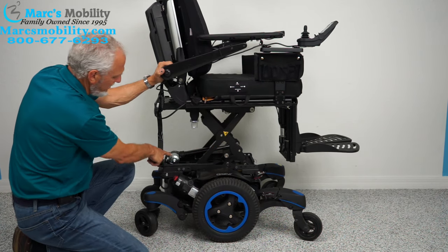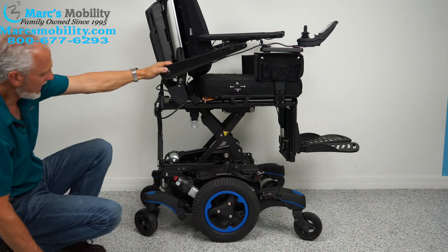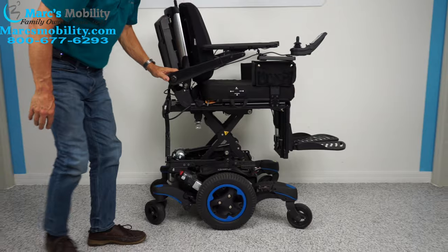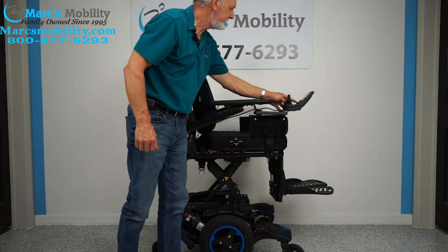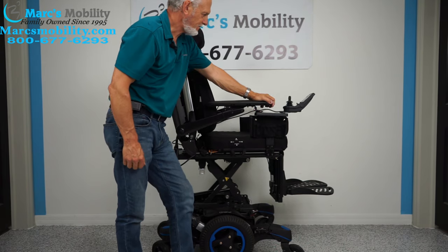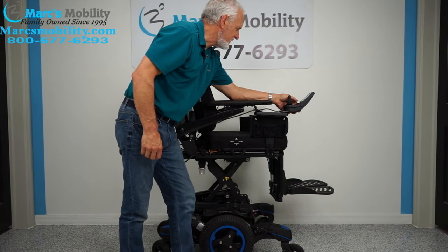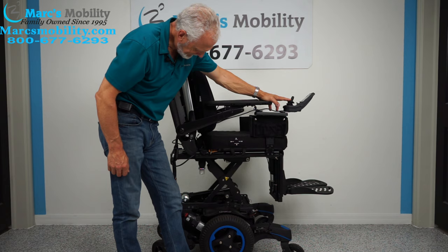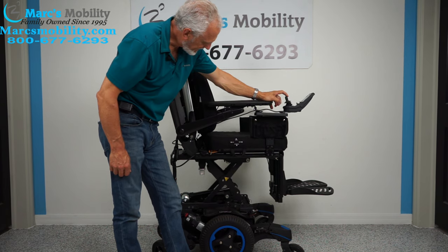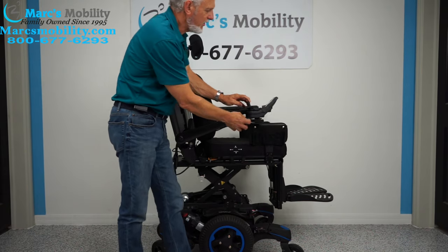You can see how the seat lift is built — this is the armature for the seat lift, and you can see the motor for the seat elevation right there. Let's turn the chair back on and bring the seat back down.